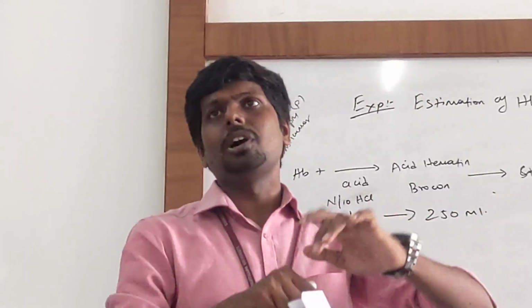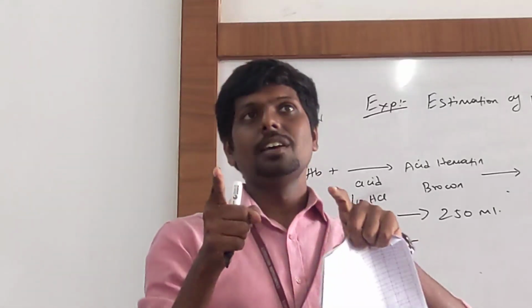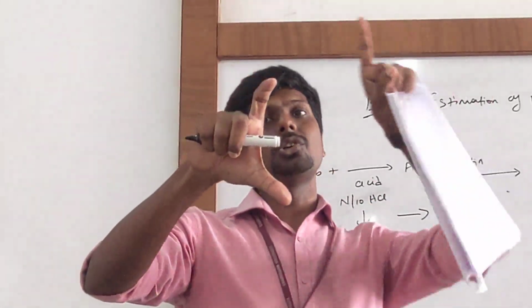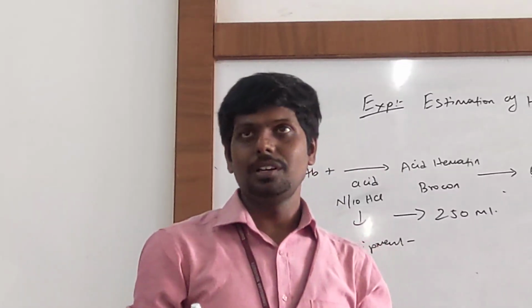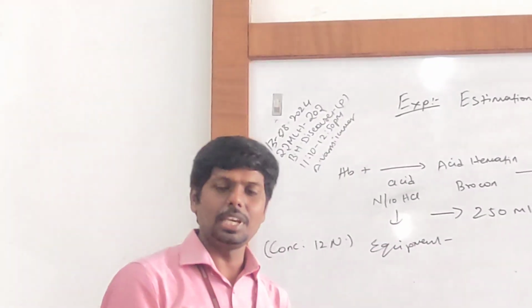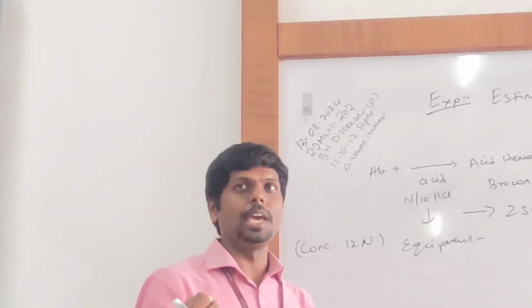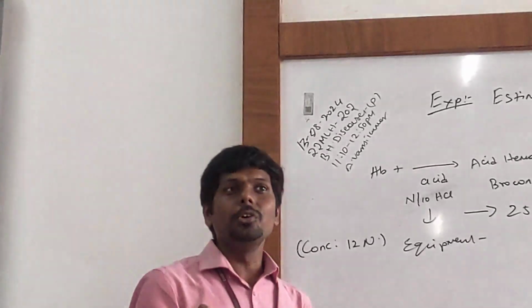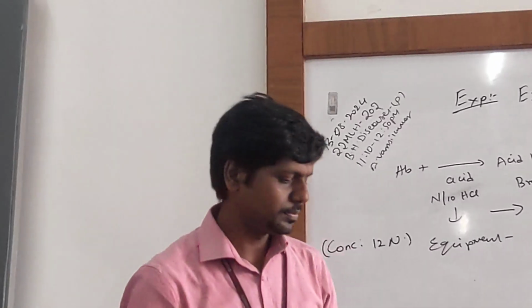To a large quantity of water, we should add acid. It's not vice versa. To a large quantity of acid, you should not add water. What happens if you add? The acid will blast. There is a proper term for it, exothermic reaction, and it will make very vigorous, very aggressive reactions.